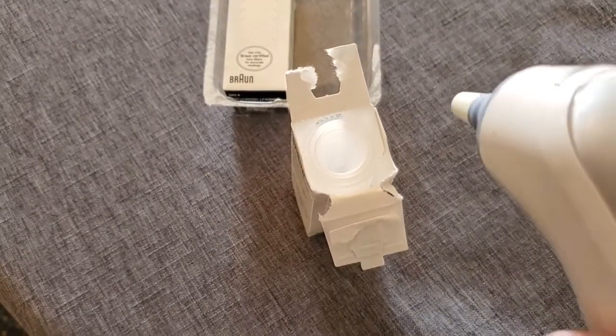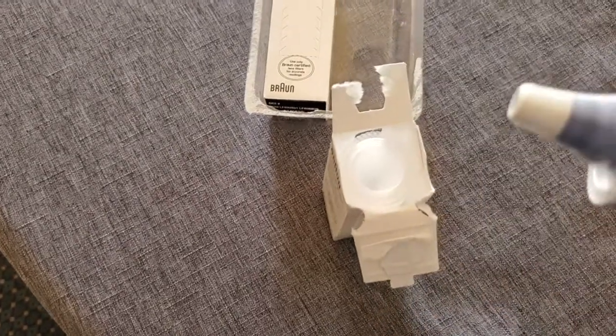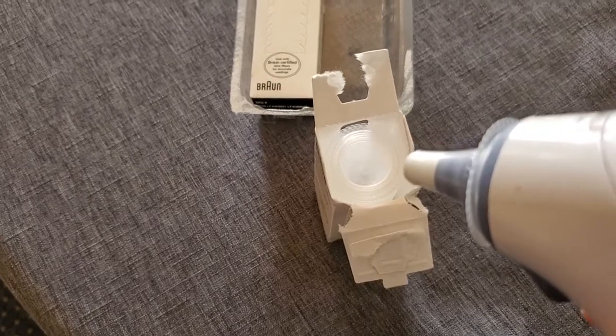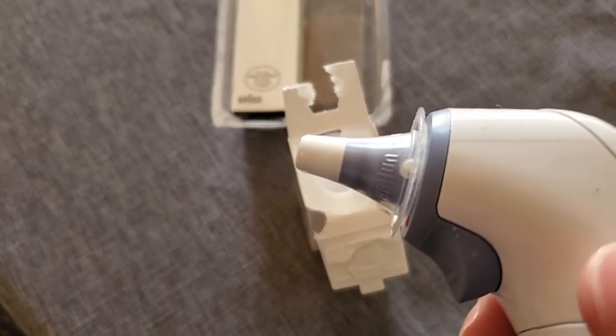It's super easy and non-contact — we're just going to press this in. It clicks right in, and it takes that new, clean probe cover right out of that stack. Really great to have that. You don't have to be touching these at all; it keeps them nice and sanitary.